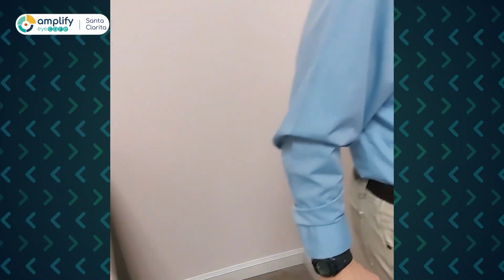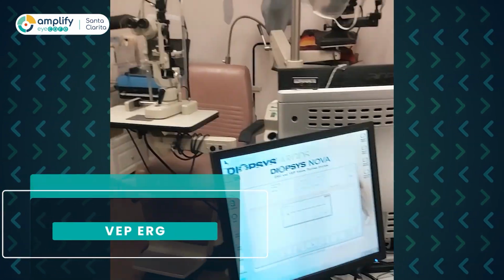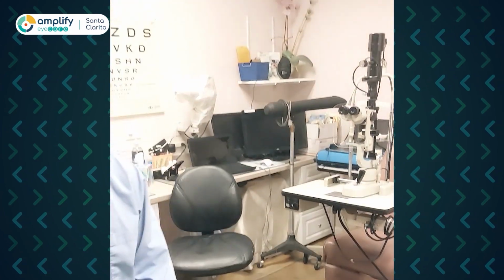And what other devices do we have? Well, we can go into the VEP. Let's go see it. All right. This is our VEP. All right, the ERG VEP. Yeah. All right, while we're waiting, the VEP ERG is two separate kinds of uses.